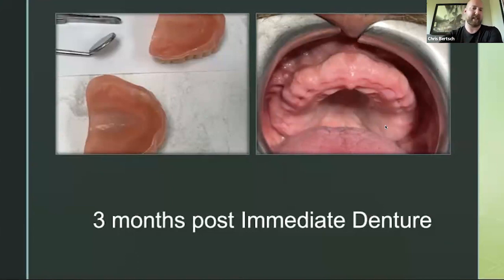And there's his denture. At one point we were doing 2 dentures, but I stopped that because then you have 2 immediate dentures, and now that we're doing the simplest reline, they would have 3 dentures, because they have the 2 immediates, which don't fit very well, and then the new one. So it's better, in my opinion, just to do the 1 denture and then do the reline digitally.